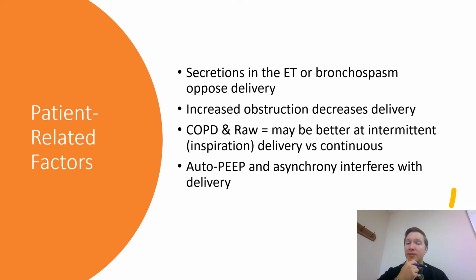And that would help, because now what happens with your expiratory time constant when you have high raw? Can you exhale very fast when you have asthma or COPD? No, right? When you do a peak flow meter, you're trying to see how fast someone can exhale, get the gas out of there. So what about on a ventilator? Can they exhale very fast? No, they have a long expiratory time constant. It takes them a long time to empty their lungs, right?